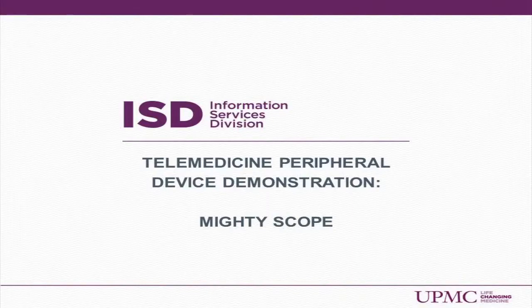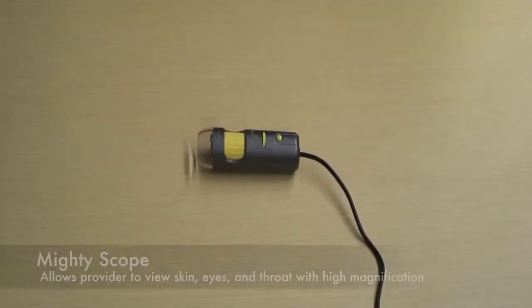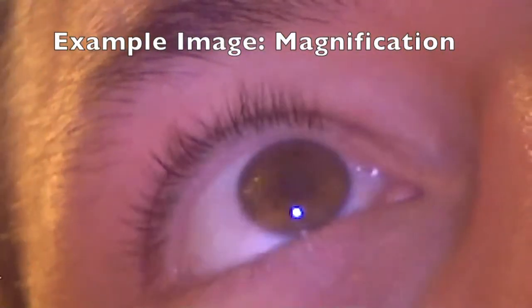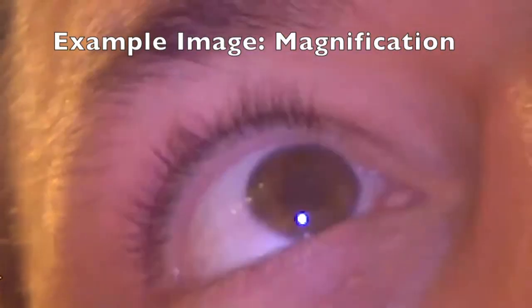Telemedicine peripheral device demonstration: the Mighty Scope. The Mighty Scope is a handheld high magnification camera that allows the provider to remotely view the skin, eyes, and throat of the patient.